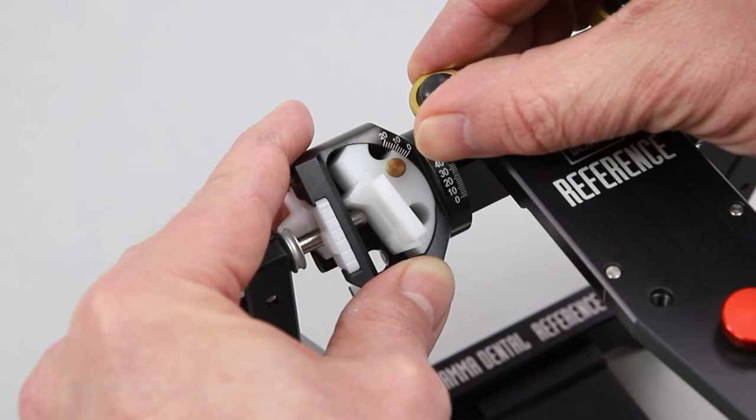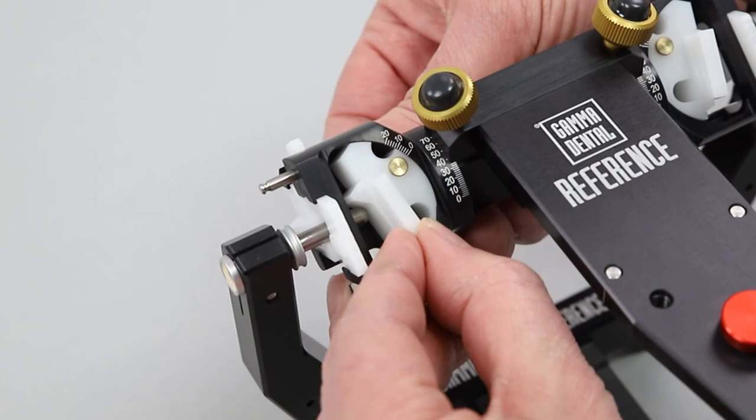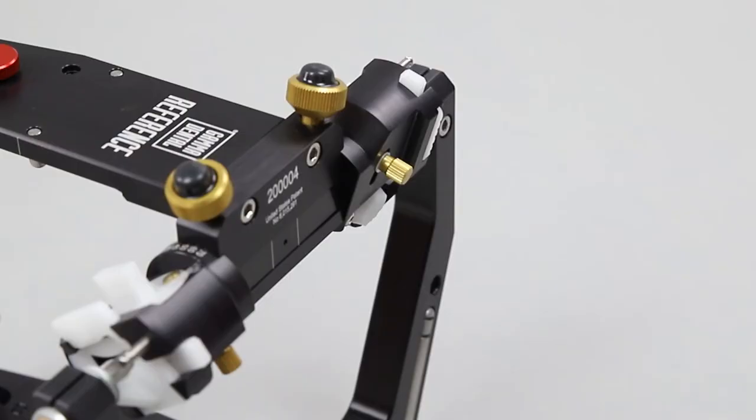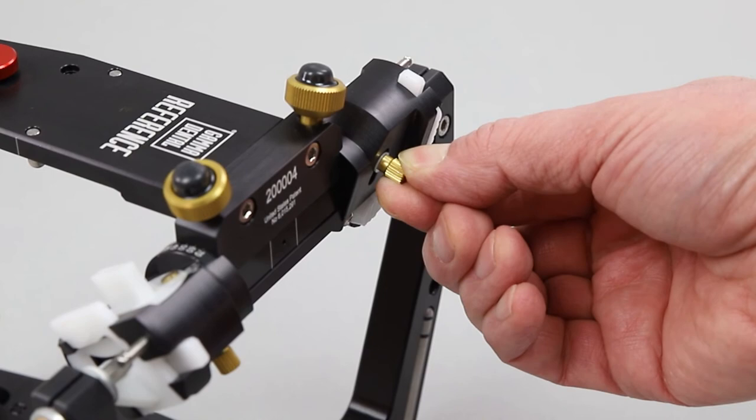The transversal or Bennett elements can be adjusted from 0 to 20 degrees. The fixation screw on the bottom of the condylar housing must be opened and closed properly again.